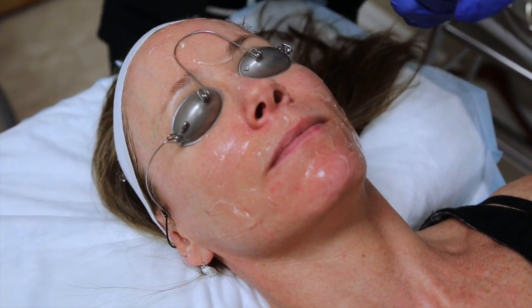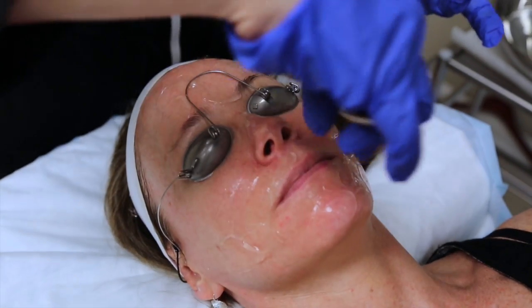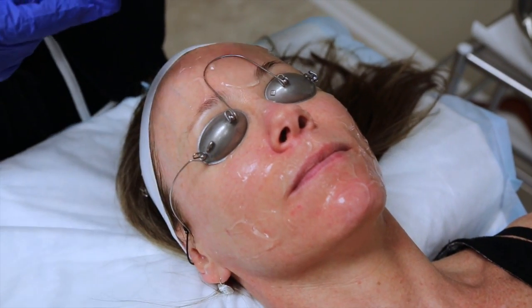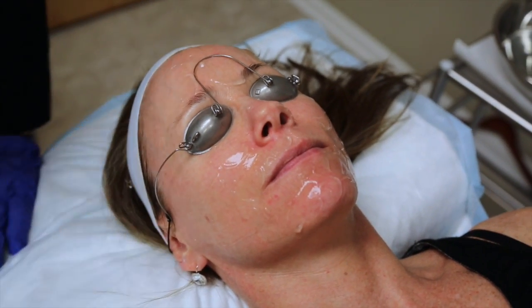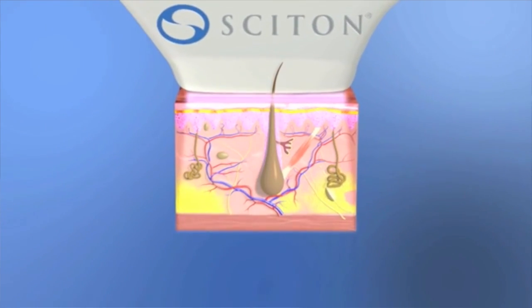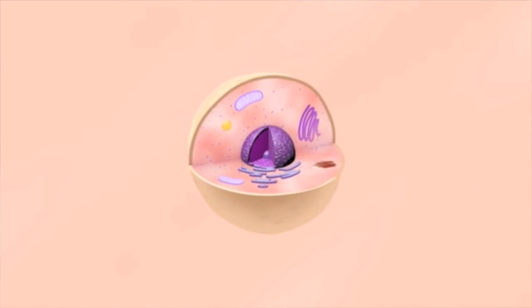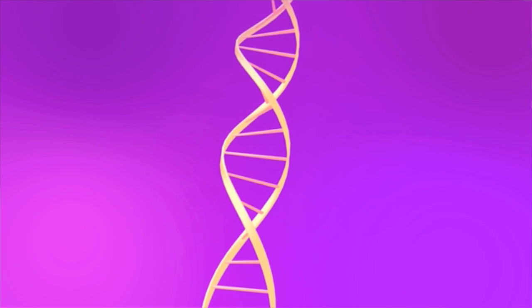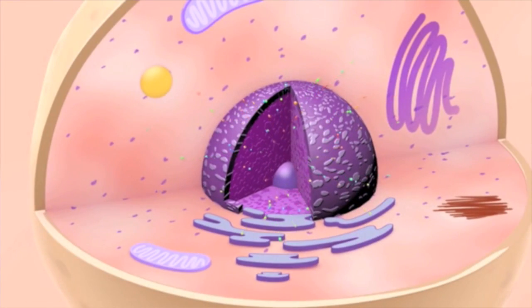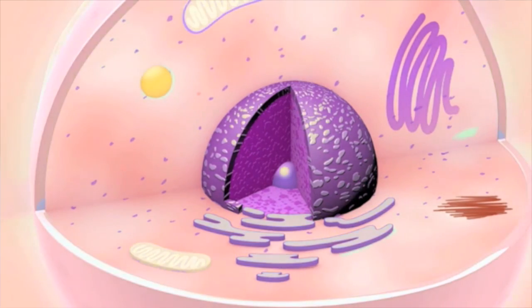As the skin ages and gets exposed to environmental insults like UV, pollutants, our diet, the RNA and DNA in the skin that makes collagen and elastin starts to break down. And by applying light in selected wavelengths, we're actually stimulating the RNA and the DNA to have those elastin factories start up again. So we actually start developing elastin and collagen in the skin as a result of the treatments.